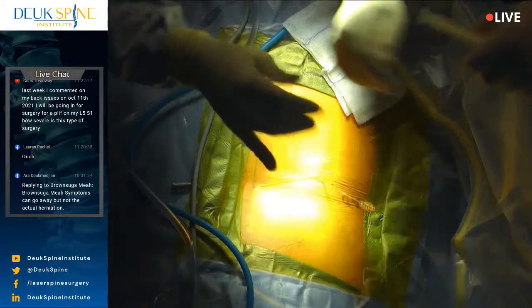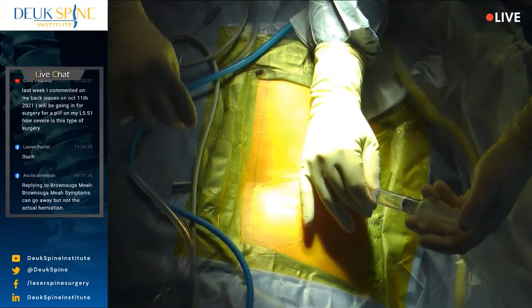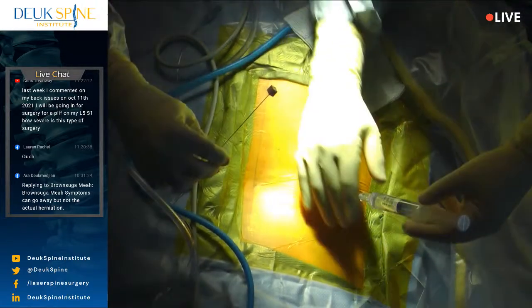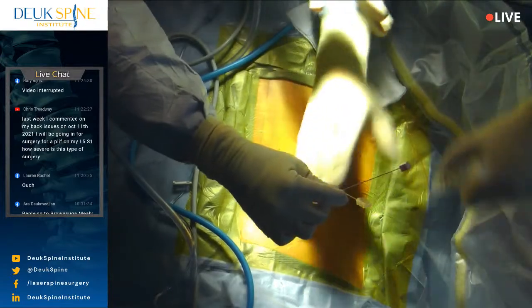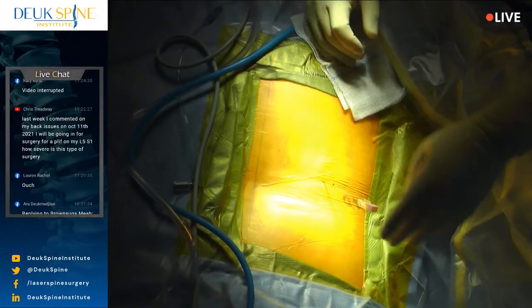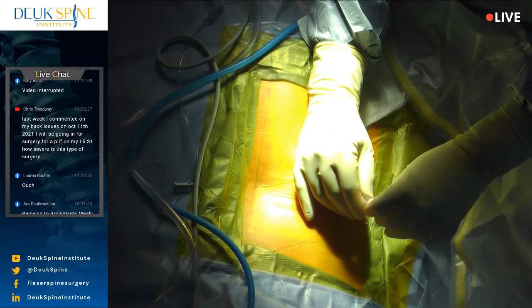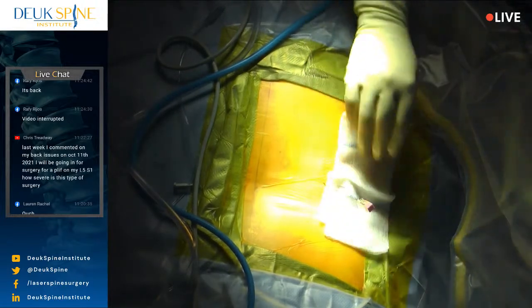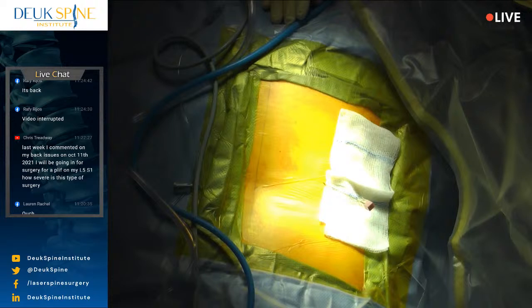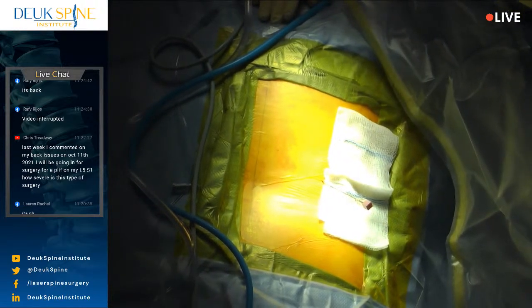So the beginning of the surgery is really about navigating. I like to talk about navigating like a ship would navigate from one place to another. And we're basically navigating down to her spine. And we're navigating to a specific place in the spine. So, for example, when a ship navigates to a country, it's not just going to go to the country, it's going to go to a very specific port where it can lay anchor or tie up to a dock and unload its goods or transact business.